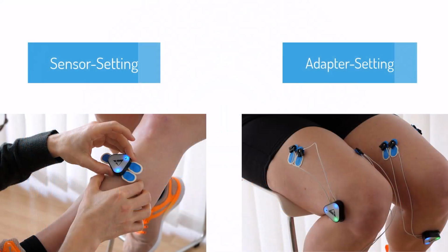First, the question is when and why to use the extension cables. To decide whether or not to use an extension cable, I need to think about two things in advance. First, how large is the muscle area? Can I place the reference electrode next to the muscle? If not, it is recommended to use the extension cables.